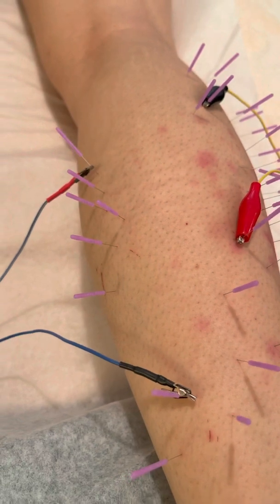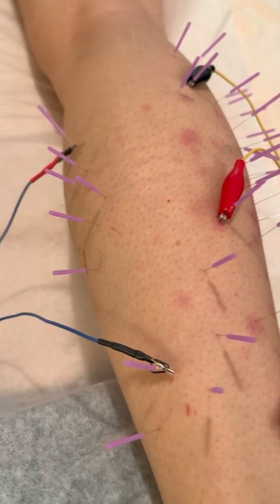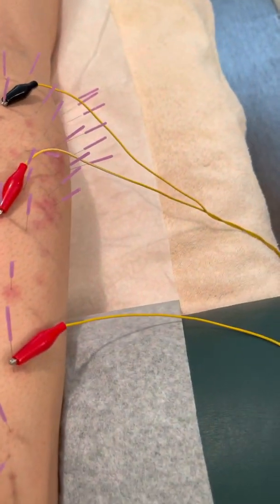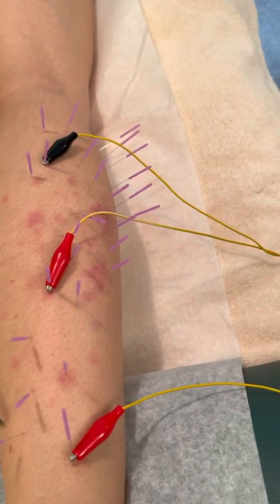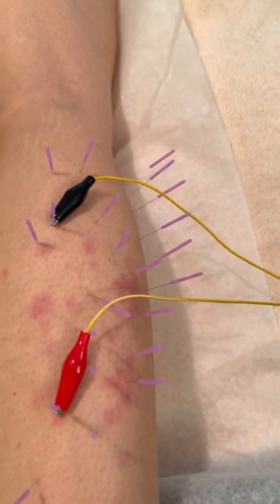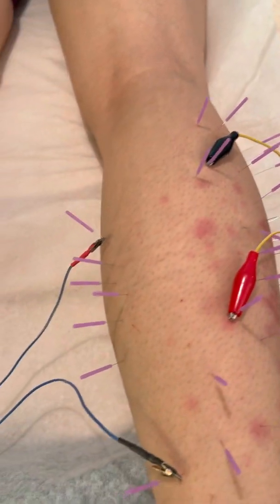And tell me how you are on the inside. Okay, I turned that up a bit too. Is that too much? No, that's great. Okay, all right. So that is, by the way, with the electrical stim, what's called the continuous mode. It's going just like 1, 2, 3, 4, 1, 2, 3, 4.